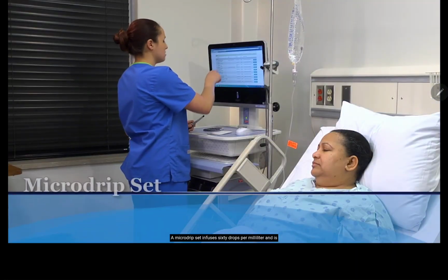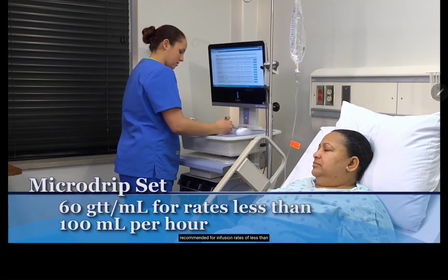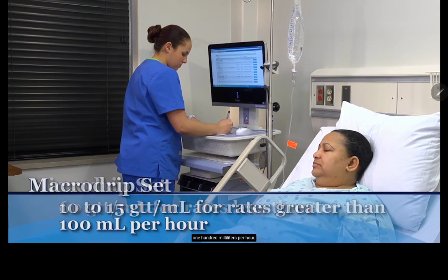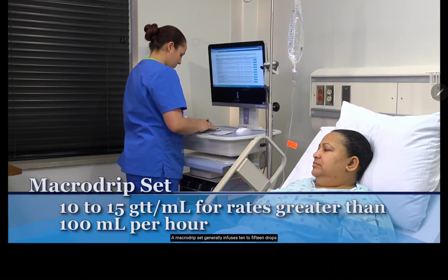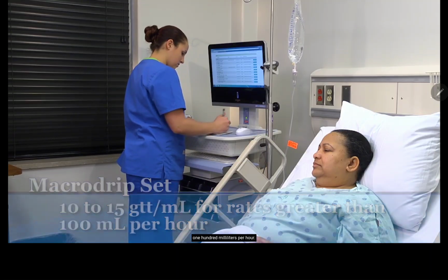A microdrip set infuses 60 drops per milliliter and is recommended for infusion rates of less than 100 milliliters per hour. A macro drip set generally infuses 10 to 15 drops per milliliter, depending on the manufacturer. It's used for infusion rates greater than 100 milliliters per hour.